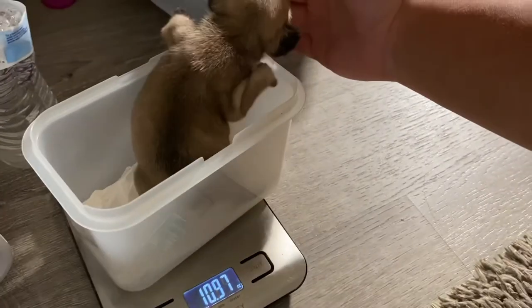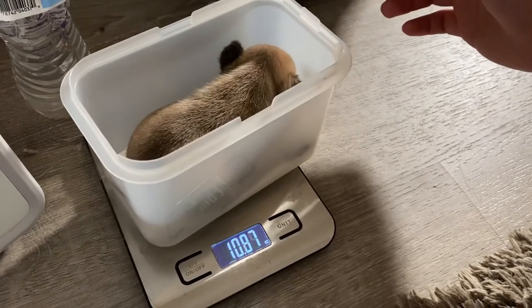How much to give the puppies: I use the one cc per ounce method. So if a puppy weighs 7.9 ounces, you give 7.9 cc's — aka milliliters — of milk. But only use this method when the puppies are a little bit older than a couple of days old. I only use this method when puppies are around four to five days old, sometimes later.